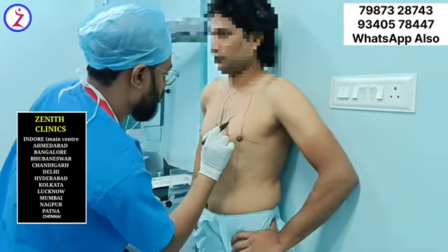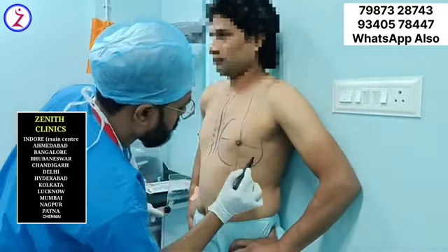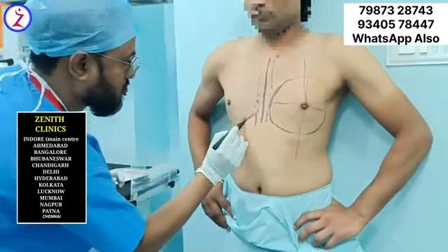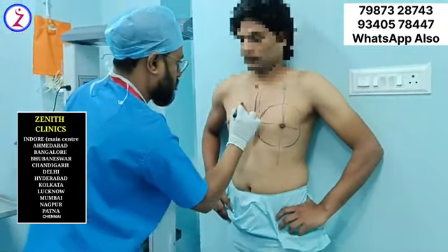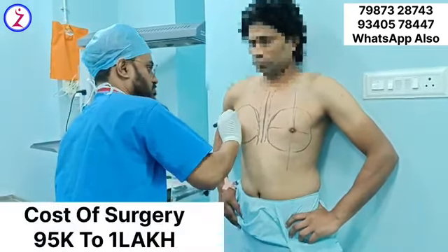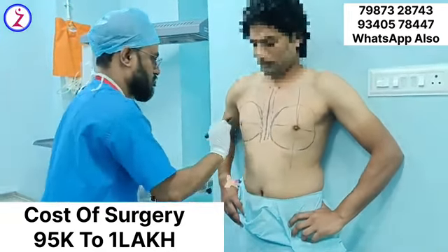In marking, we usually mark the midline and mark 2.5 centimeters on either side of the midline, so that both the implants will not meet at the midline. We'll mark the possible boundary of the breast, the possible breast tissue, and then divide it into 4 quadrants, and we also mark the IMF, the inframammary fold. Typically in a male chest, the IMF may not be so prominent, so we have to identify the IMF. Then we'll take an incision just below the IMF, and after marking the boundary of the breast implant, we'll mark the nipple position from the midline, from the mid clavicular line.